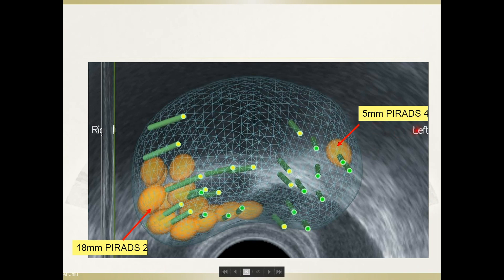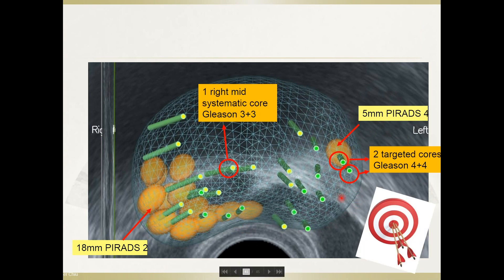This is another case with a 5 mm PI-RADS 4 lesion at the left anterior peripheral zone. We targeted it accurately and also performed systematic biopsies, confirming that despite a Gleason 4+4 high-grade cancer on this side, there was no other high-grade cancer elsewhere in the prostate. There was a Gleason 3+3, one core over the right transitional zone. The patient was eventually treated with HIFU.